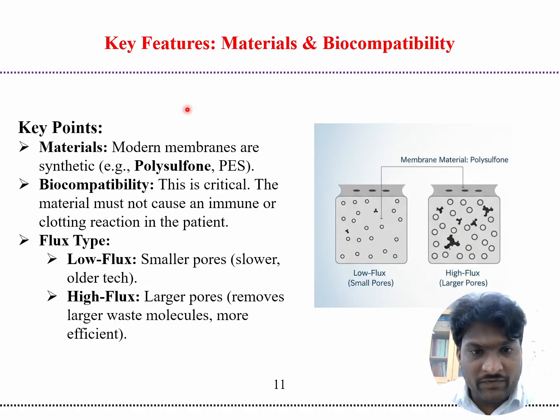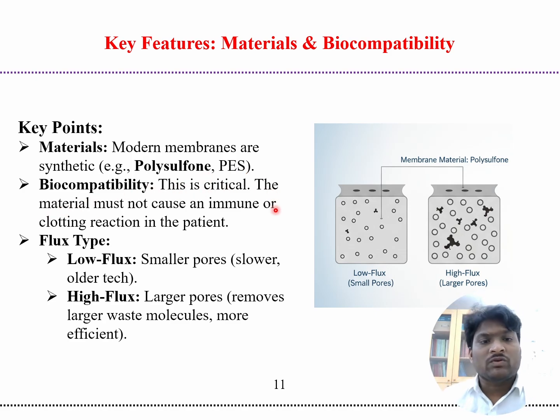And the key features are the materials and biocompatibility. The materials: modern membranes are synthetic, like polysulfone, PES. And biocompatibility is critical. The material must not cause an immune or clotting reaction in the patient. So it's the most important thing.